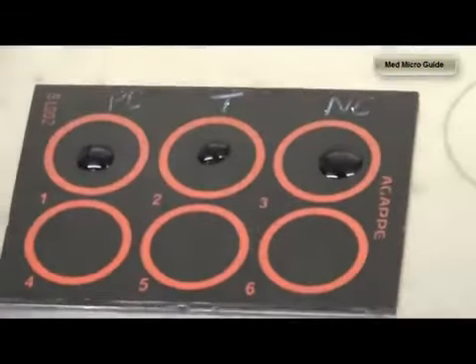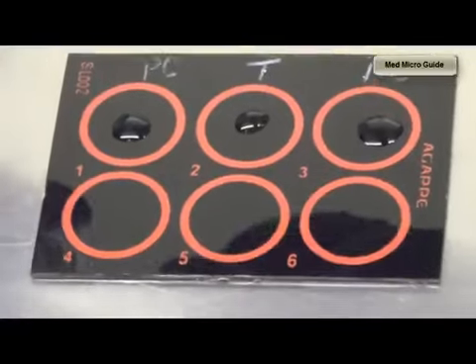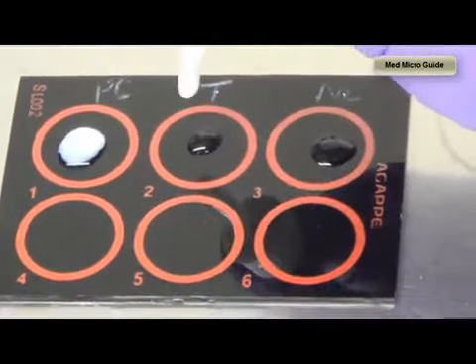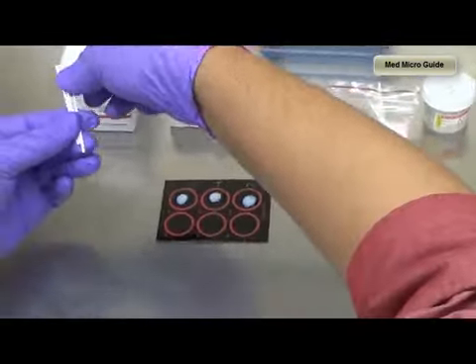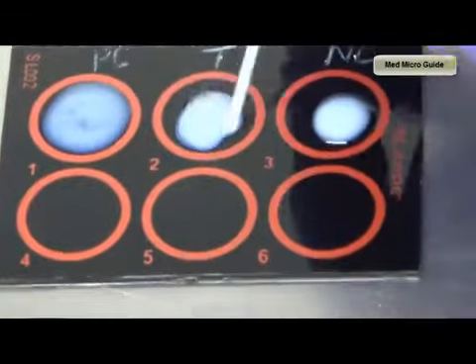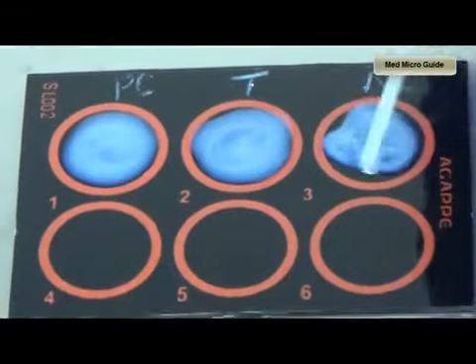Now we will add one drop of the ASO reagent to each of the circles. Once the reagent is added, we have to mix the reagents using a separate applicator stick for each sample.